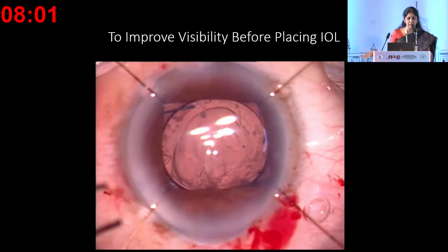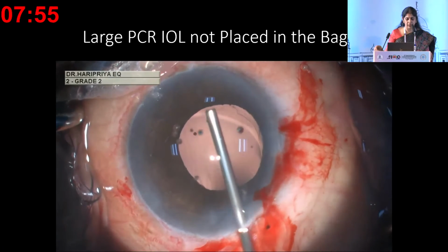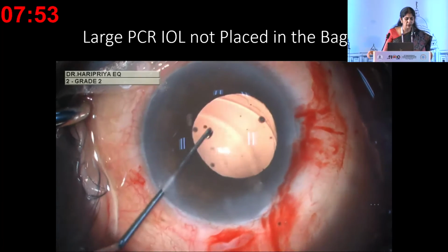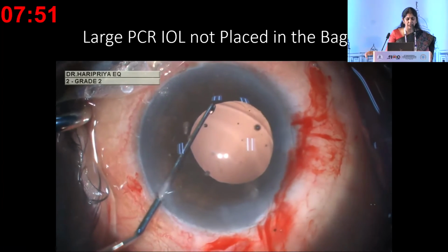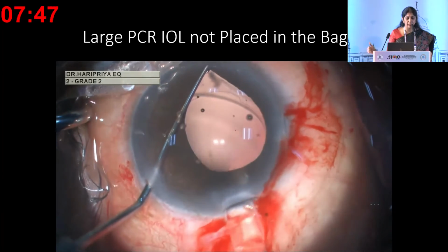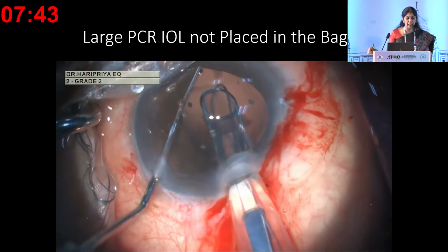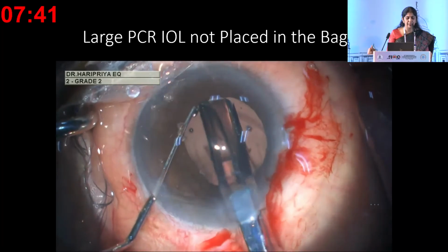You may think you're placing it in the sulcus, but this may go into the bag, in which case the IOL will decenter and even dislocate. Even if your pupil is not very small, like in patients who have a slightly larger pupil, if you're using a plunger for an injector, one can do this one-handed implantation. With the other hand, use a Kuglin's hook and retract the iris.